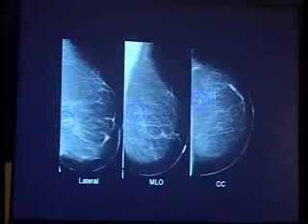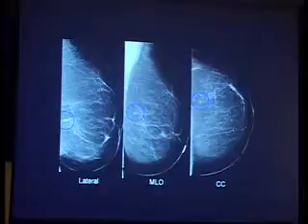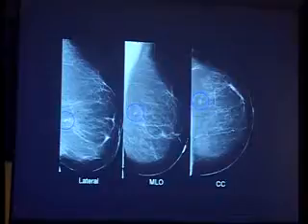So this is going to be kind of a mid-outer posterior breast, very small, less than a centimeter, and it's against fatty tissue, okay? And the lesson, too, is that with ultrasound, it is more difficult to see cancers in fatty tissue, okay, than in dense tissue.